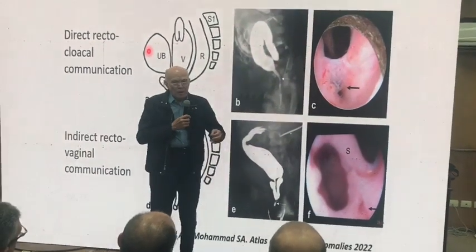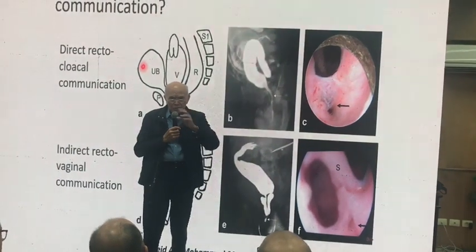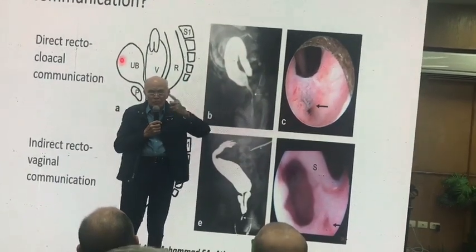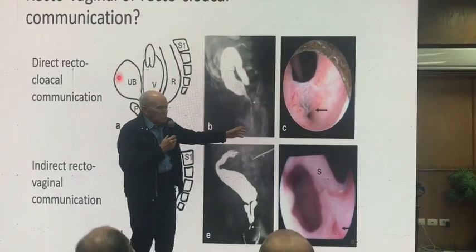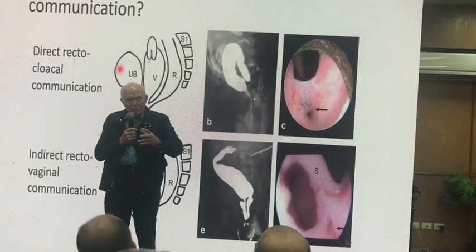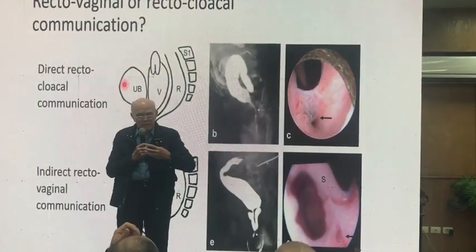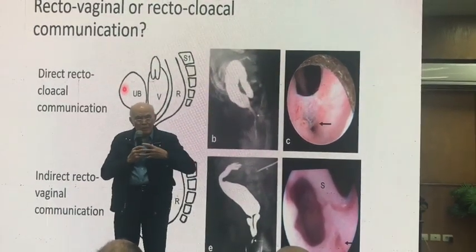So in summary, you will see a patient with a cloaca. You need a good look at the perineum. It's flat, it has a midline groove, it has a good sphincter, and then you need a distal colostogram to know how much bowel you have. And then you go from below, and you cannot do a good distal colostogram in cloacas because the contrast escapes from below. In anorectal malformations in males, you can put hydrostatic pressure and distend the rectum and see exactly what it is. In cloacas or vestibular fistulas or vaginal fistulas, there is no way to generate enough pressure to distend the rectum and overcome the muscle tone of the sphincter.